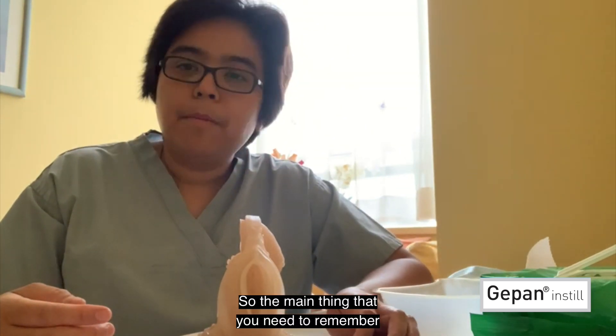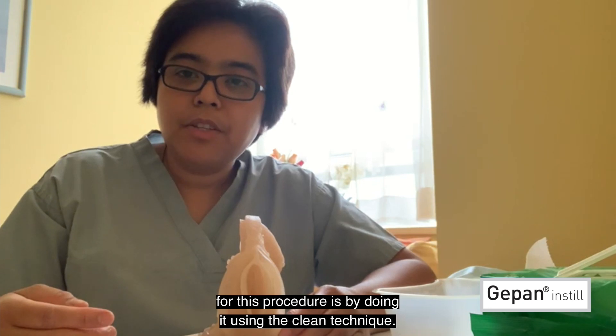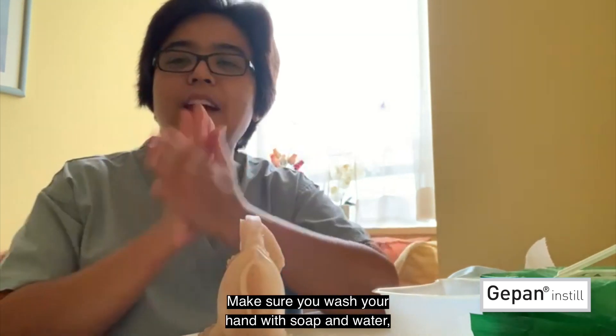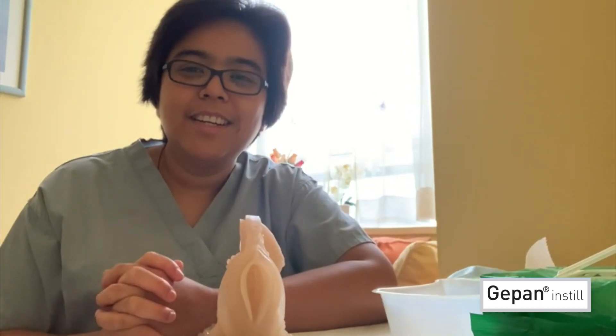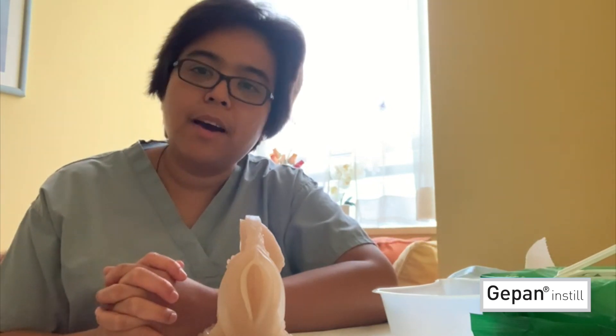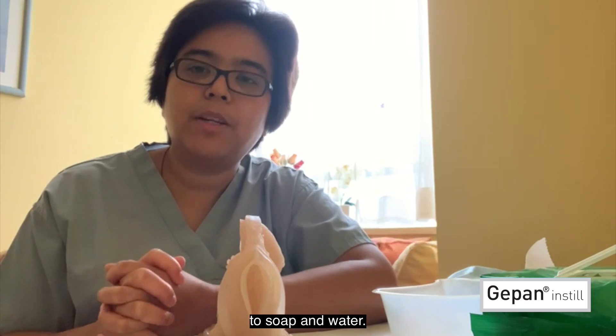The main thing that you need to remember for this procedure is doing it using the clean technique. Make sure you wash your hands with soap and water, or you can use an alcohol sanitizer should you have no access to soap and water.